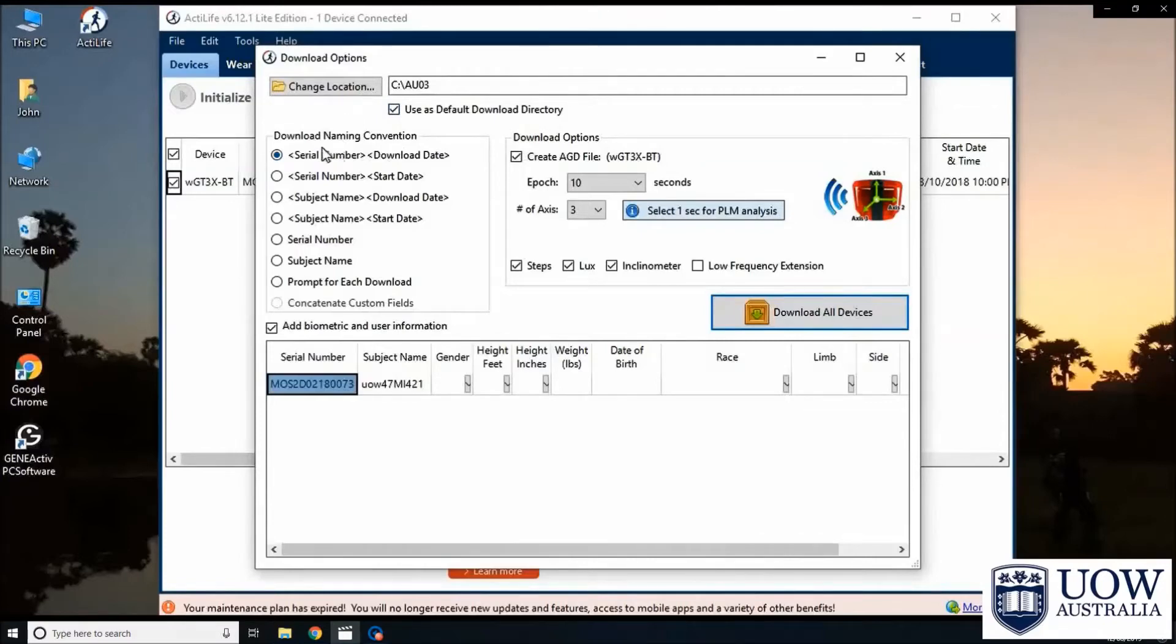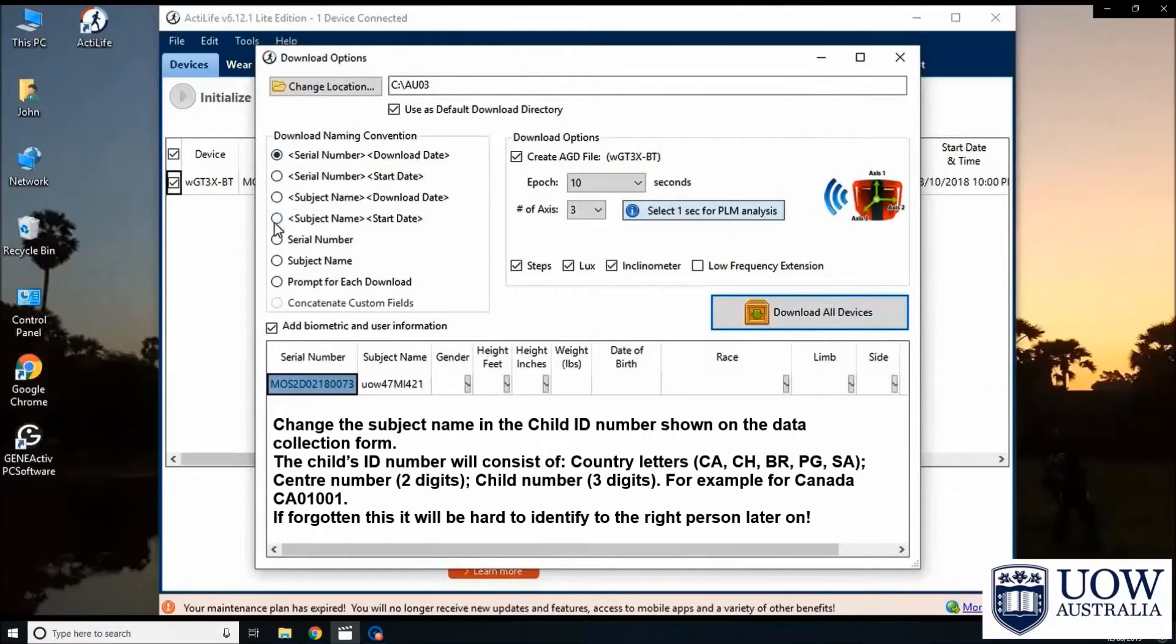Next, for download naming convention, select the option with both subject name and start date.